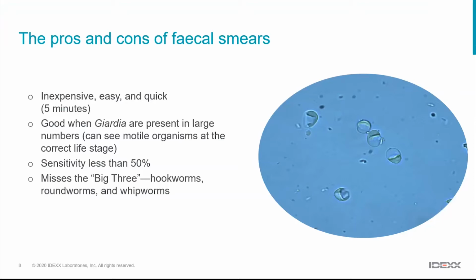But even for giardia, important to realise that the sensitivity is less than 50%. So it's not saying it's not worth doing. It's a simple test. It's inexpensive to do.